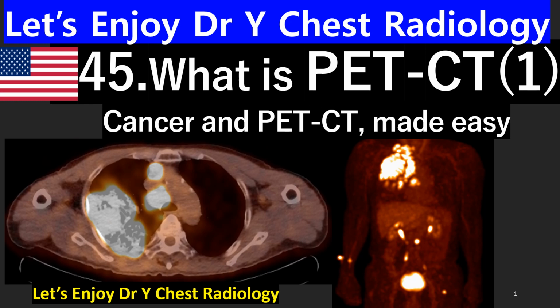Today we're gonna talk about PET-CT. Chapter 45. What is PET-CT? Cancer and PET-CT made easy. Let's go.